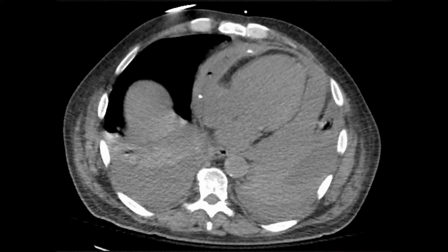This is the CT scan of the patient's chest, and here you see the heart, and it's surrounded by this pericardial effusion that's denser than normal fluid that you would expect. You also see this little air pocket here, which is what we were seeing, that dirty shadowing on the parasternal short view.